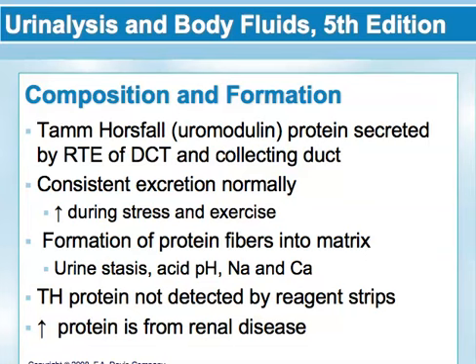Formation of casts occurs more readily during urine stasis in an acid pH and when there are increased levels of sodium and calcium present. And Tamm-Horsfall is not detected by the reagent strip because the strips, if you remember, we mentioned previously, are most sensitive to albumin.